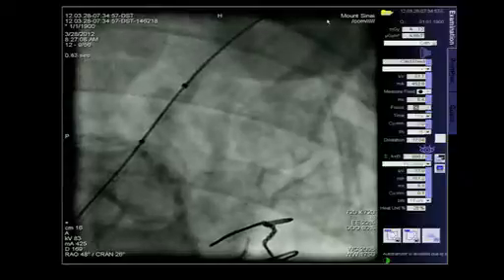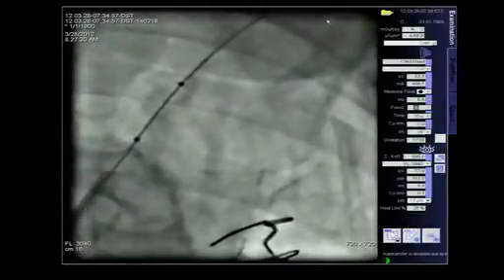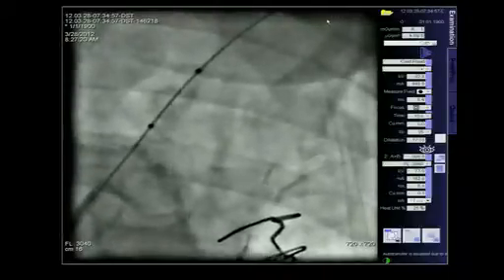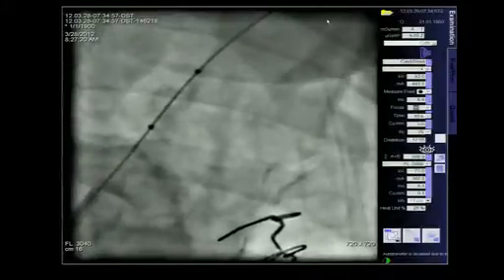So now I'm going to advance this balloon, guys. So we're going to advance forward. Okay. I'm going to have to go up there. I know it's across the vert a little bit, but we're going to go up. We definitely do want to expand this.